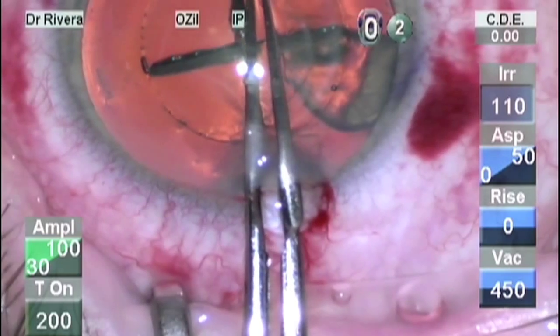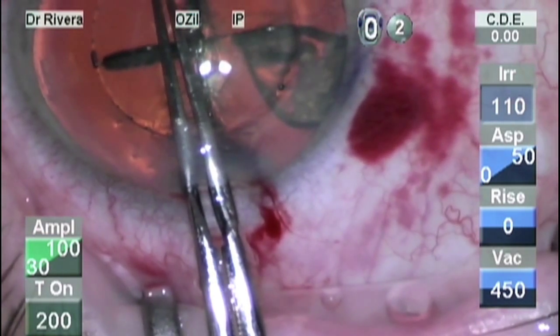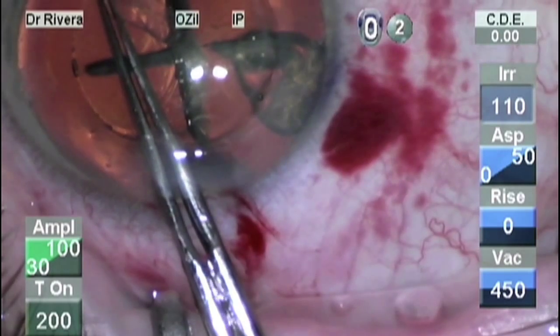Yeah, there's quite a bit of adherent capsule right there. It's just basically tearing as I open it.